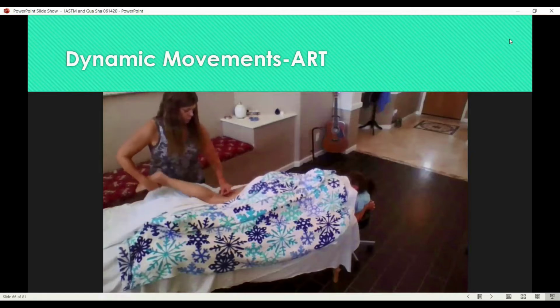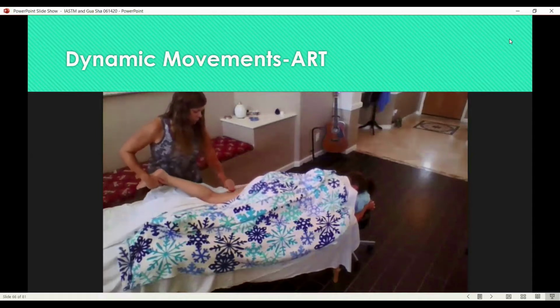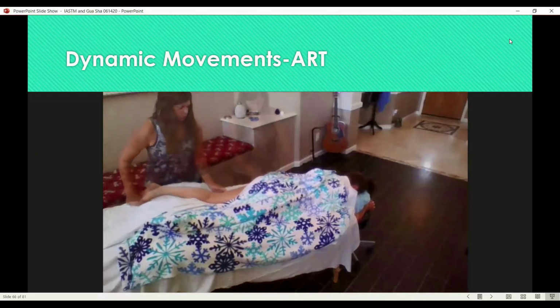And then we're adding in the hamstring, right? And the motion there, we're making the leg move, extending at the knee. Do a little brushing, multi-directional.